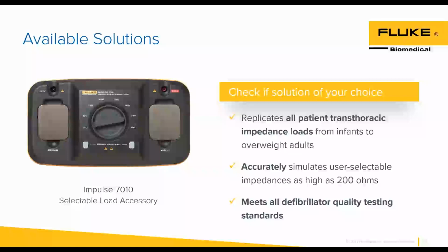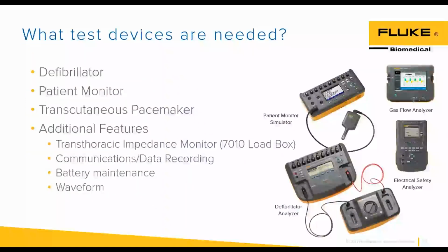Well, that's a lot of information. And there are a lot of things to think about testing on a defibrillator. So that's a lot of analyzers, Elliot. Yeah. So like we talked about, right? The modern defibrillator kind of has, again, like three different pieces of medical equipment in them: defibrillator, patient monitor, and potentially a pacer.